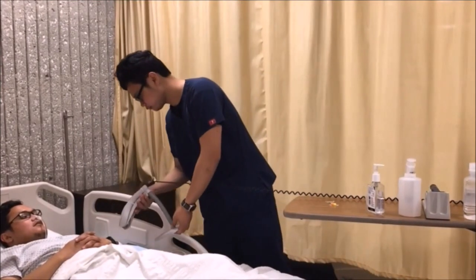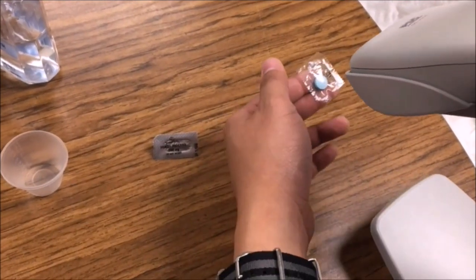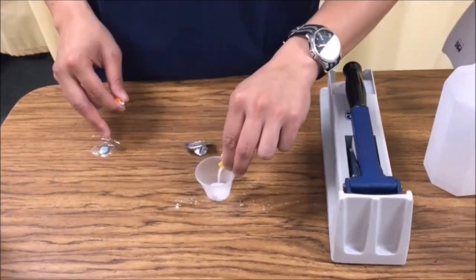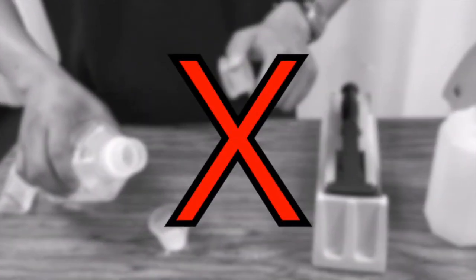Alright, let me just scan your ID band real quick. Wait, is he making another error? Yeah — when crushing and mixing medications, do not mix different medications in one cup. Medications may interact and clog the tube, making the tube unusable. Also, on a side note, remember not to crush any enteric-coated medications. These medications may be labeled EC, XR, SR, or ER depending on the manufacturer. Crushing these medications will increase the amount of medication absorbed in a smaller amount of time, causing severe drug toxicity.